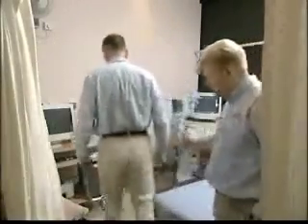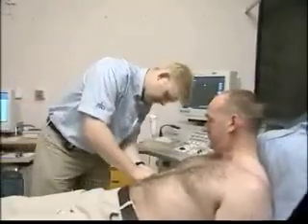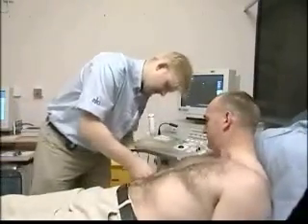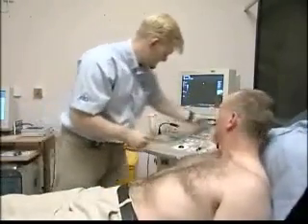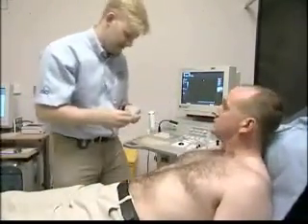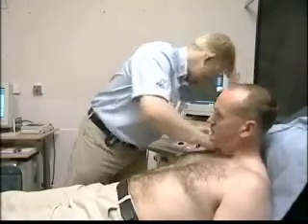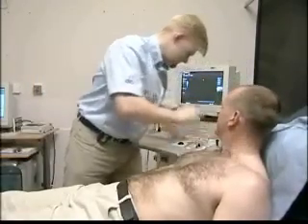This patient has been sent by his GP for an ultrasound investigation of the heart. Ultrasound has a number of key advantages: it's quick, cost effective, and has virtually no associated hazards. It's also far more acceptable to many patients than some other modalities.